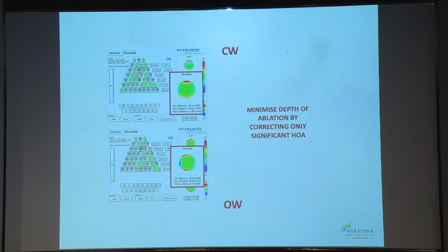When you use technologies from, say, Alcon or Zeiss, this interface does not exist. The machine assumes that the entire cohort is a culprit, so it uses a carpet bombing effect. So why do we need this? Every time we take one of those aberrations out, you save 1 or 2 microns of tissue.